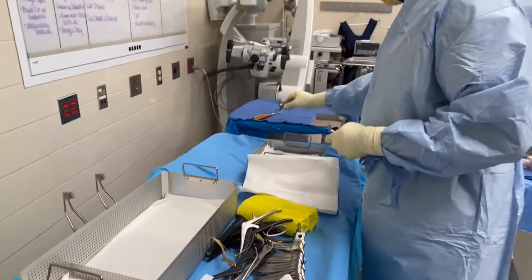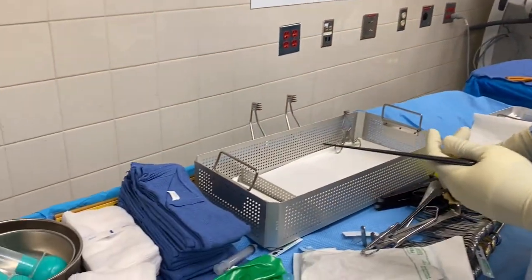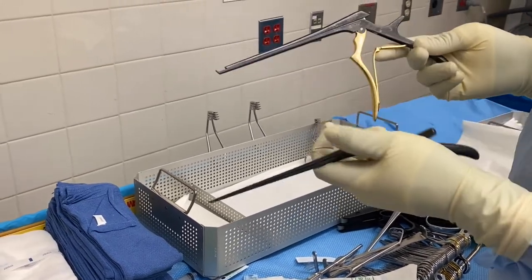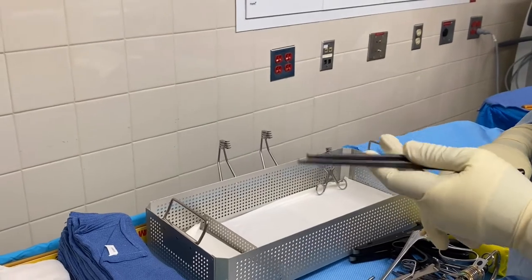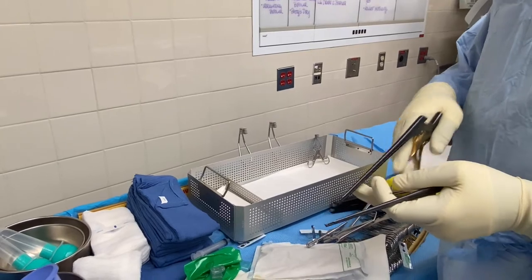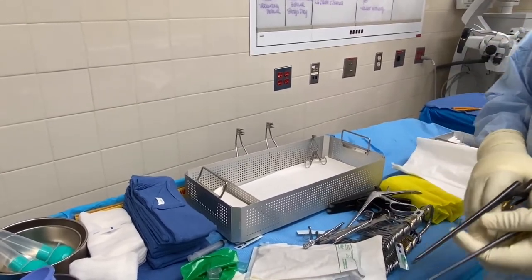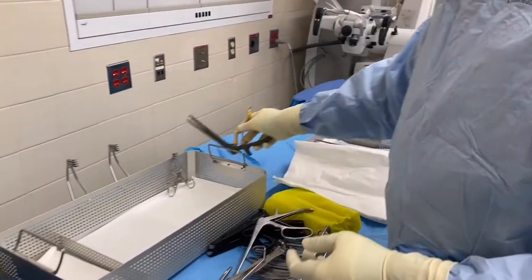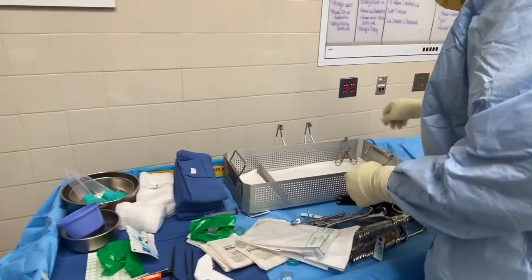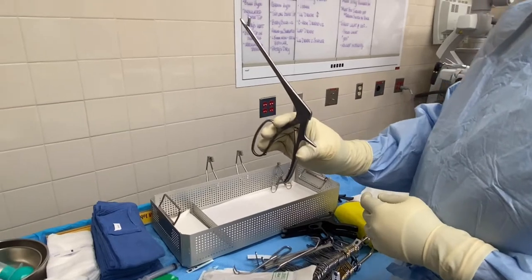Next to my Kerrison — these are Kerrisons: Kerrison 3 and Kerrison 2. We usually use them just to clean the bone before we get access to the dura, to make sure we get rid of all the excess bone. This is a Kerrison 3, Kerrison 2, and this is a pituitary rongeur.